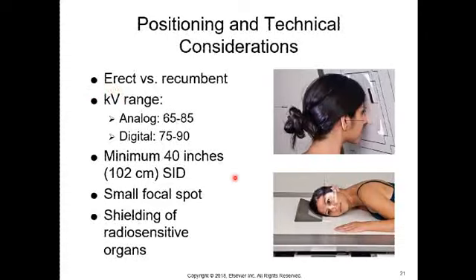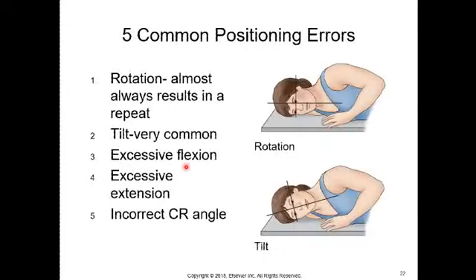Okay. Most skull work is done at 40 inches. Some hospitals do something different, but for your test purposes, you need to know 40 inches. You want to use a small focal spot because you want fine detail. And obviously you want to shield as best as possible.